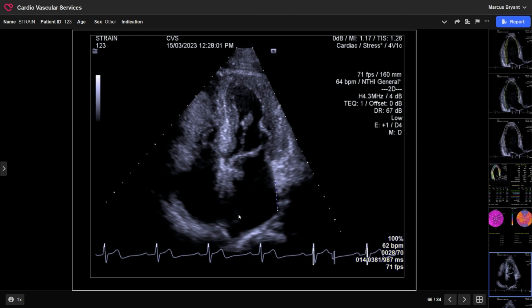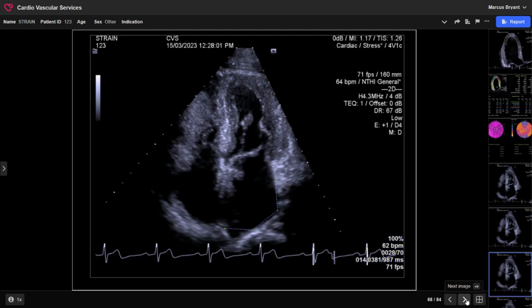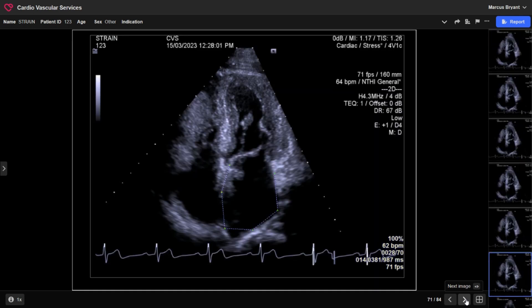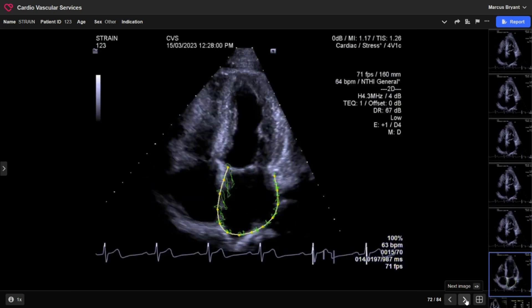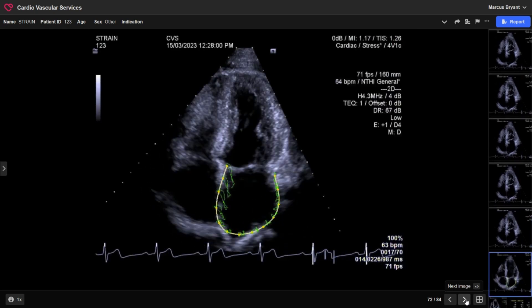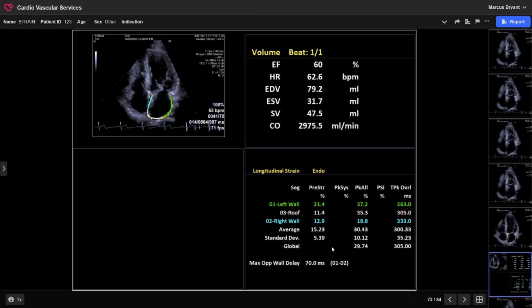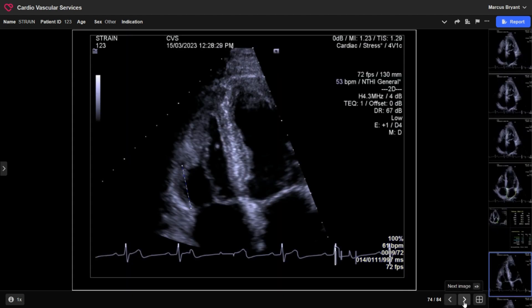With left atrial strain, if I was doing pure left atrial strain I would have actually narrowed the section to focus just on the left atrium, but for the sake of this I've included the full chamber view. I pick my first point up at the annulus, then in the same way come down and around with just a few points, then run it. We can see it tracking pretty well. The numbers we're playing with are over here, and as I say there are different elements we look at with atrial strain, but I won't go into that too much.